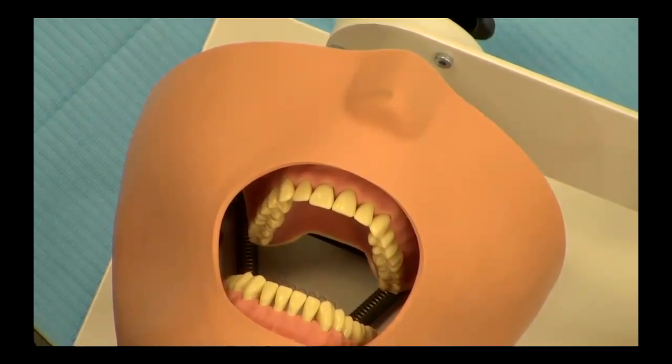Next, we shall look at the role of your non-dominant hand. The hand in which you are holding the forceps is your dominant hand, and the other hand has a very important function during tooth extractions. You can't keep it in your pocket, so it performs a number of functions.